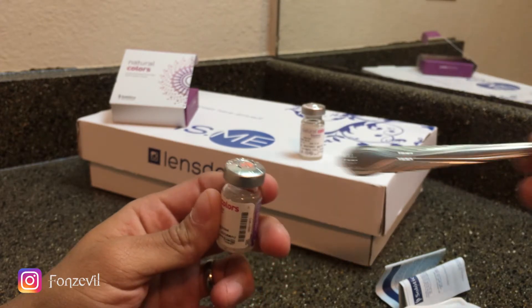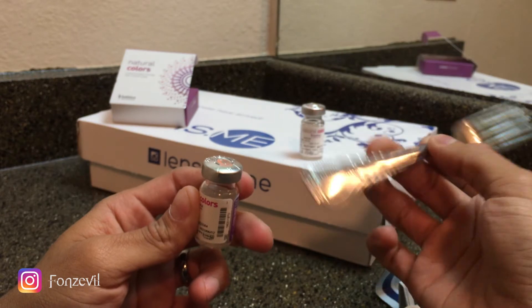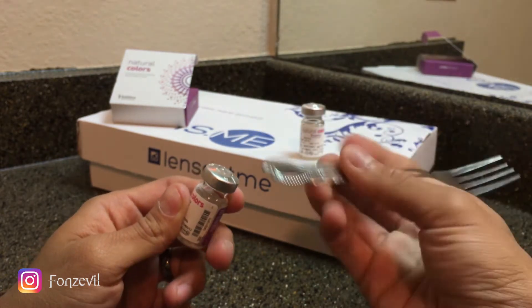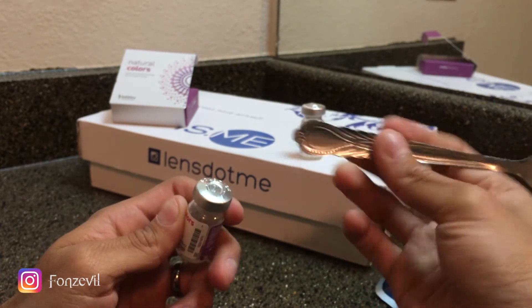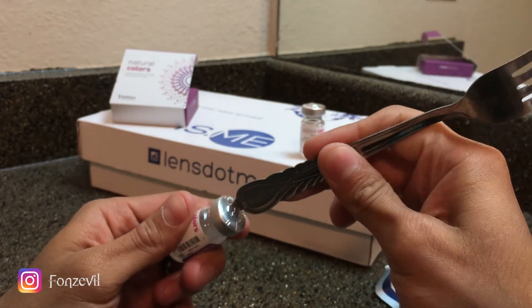I use a fork. Yes, I know it sounds crazy, but I use a fork. I don't use the top of it — I use the back of my fork. You guys can get a spoon, a fork, anything really that has a little dent in there that can fit perfectly inside the hole.